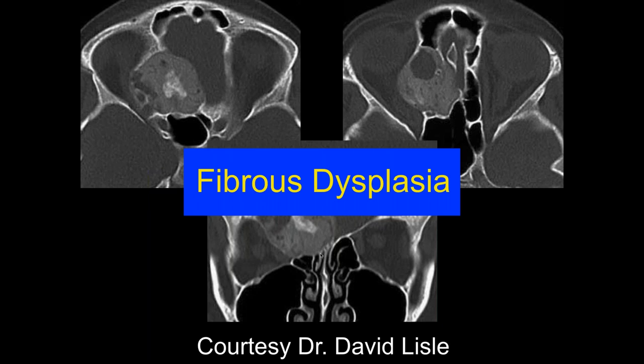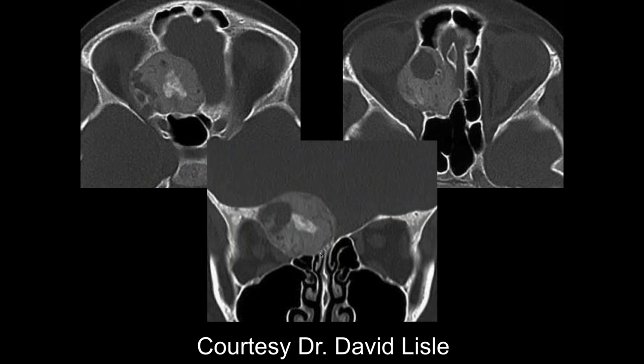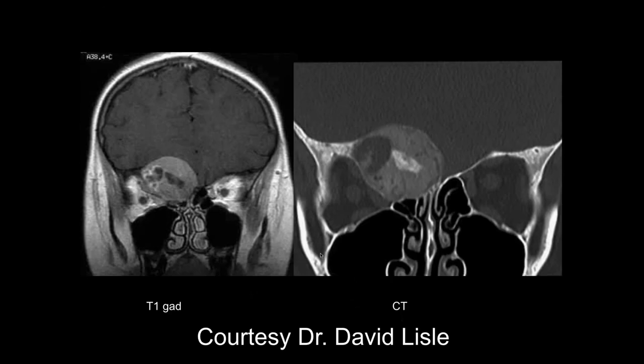Great. At the age of 35. Wow. Sam, do you have a question? Sorry, this doesn't look like any fibrous dysplasia that I've ever seen. I'm wondering, what are the components of this? The soft tissue component looks like fat almost. If I saw this in a pelvis, I'd say this were a dermoid. Isn't that fat? What is all that soft tissue? It's like a mass? What are we looking at physiologically?